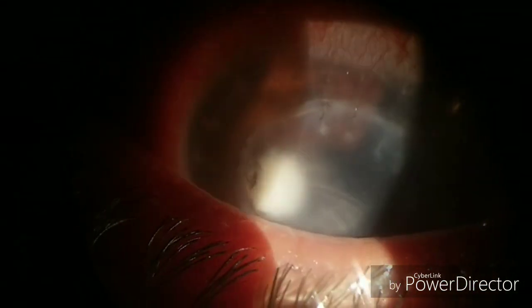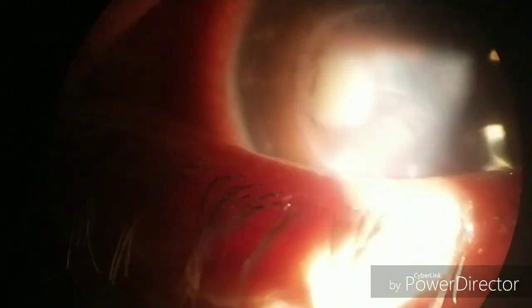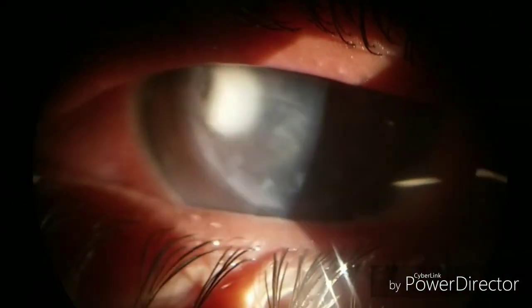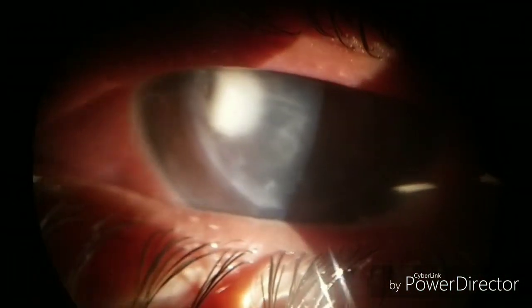We have given antibacterial and antifungal antibiotics and will monitor the response. First of all, you should know the definition of keratoplasty or corneal grafting: it is a surgical procedure in which the diseased host cornea is replaced by a healthy donor cornea. To answer the first question, see the stitches — if all are present, it means it was recently performed.